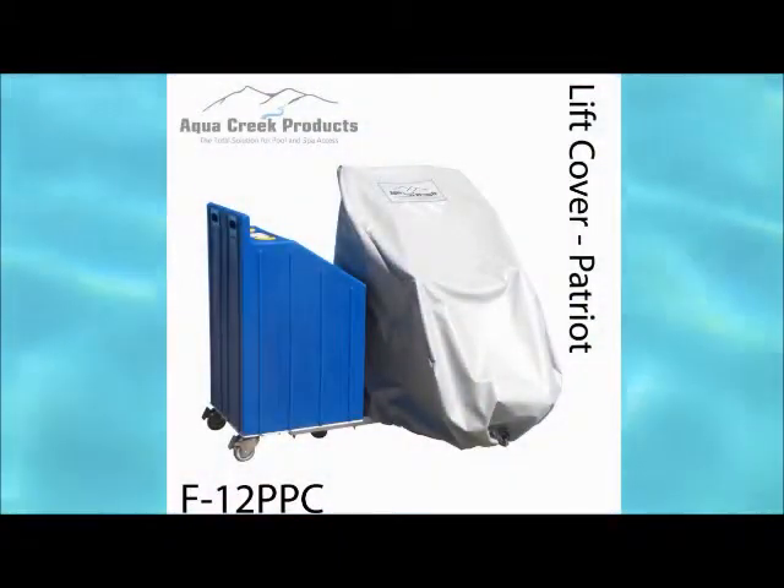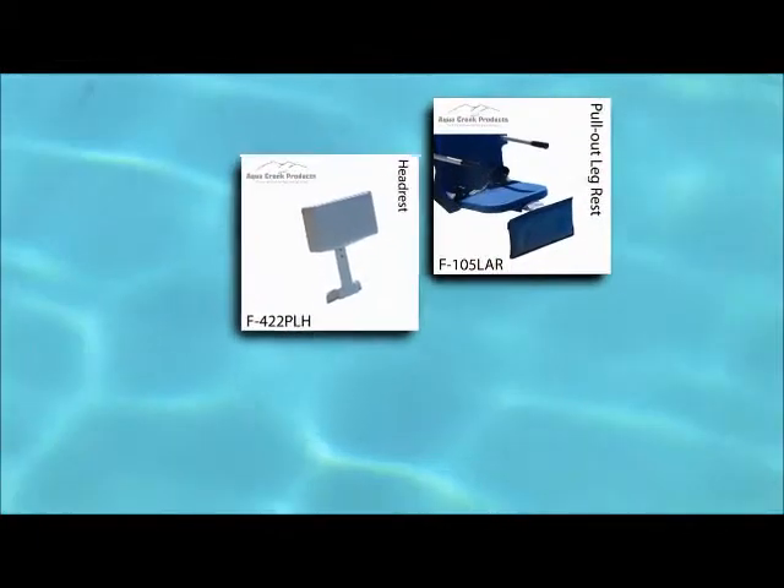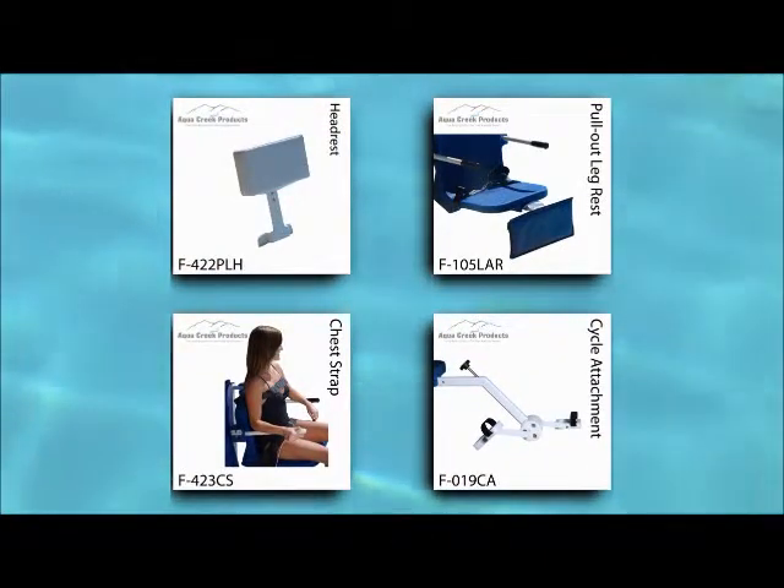Aqua Creek also offers an optional cover to place over the lift when not in use. Additional options include a pull-out leg rest, a head rest, a chest strap, and our unique cycle attachment that turns the lift into an aquatic exercise machine.